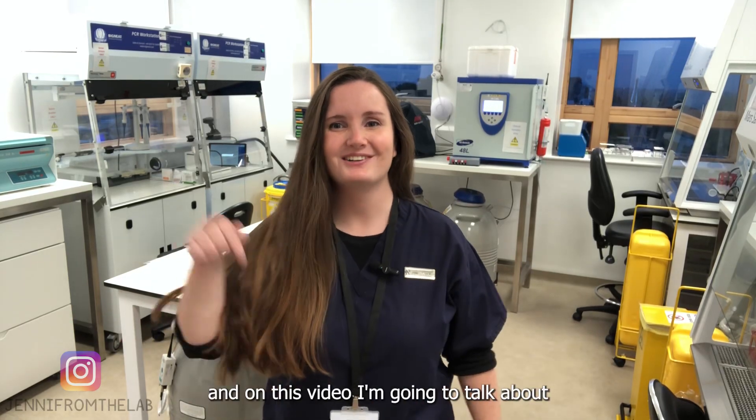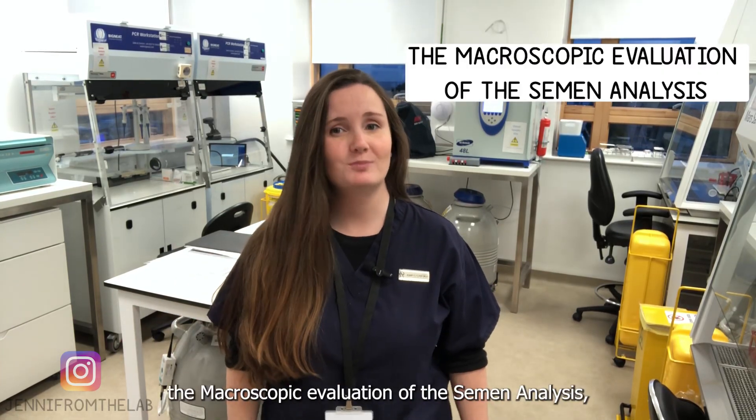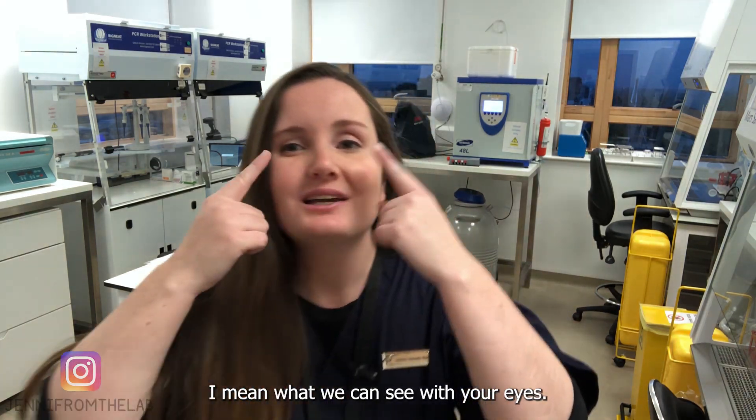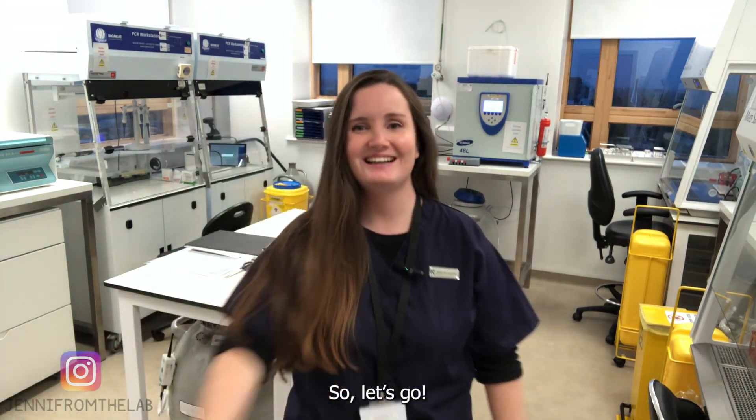Hi, this is Jenny from the lab. In this video I'm going to talk about the macroscopic evaluation of the semen analysis — by macroscopic I mean what you can see with your eyes.